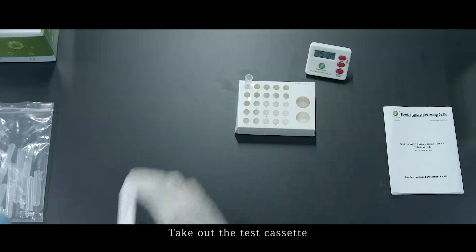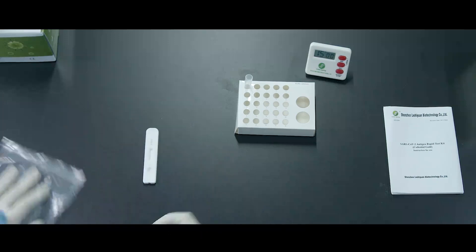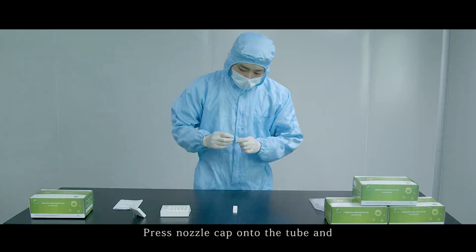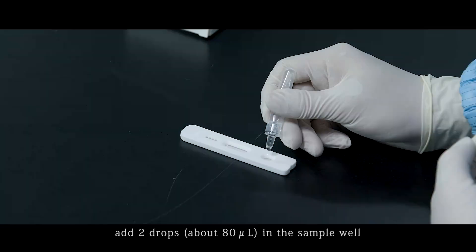Take out the test cassette. Press nozzle cap onto the tube and add 2 drops about 80 microliters in a sample well.